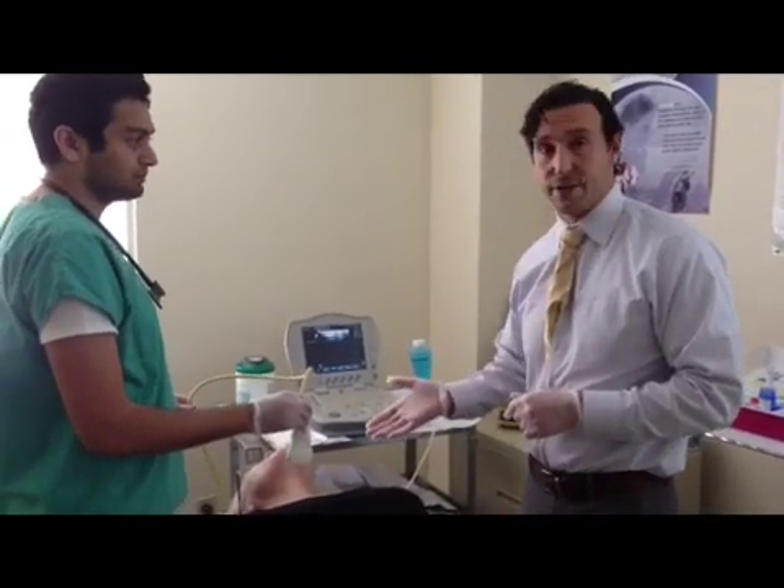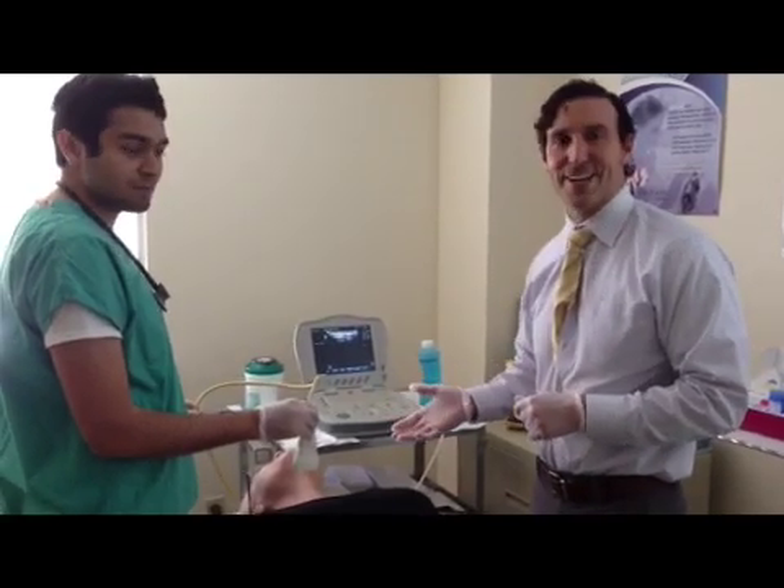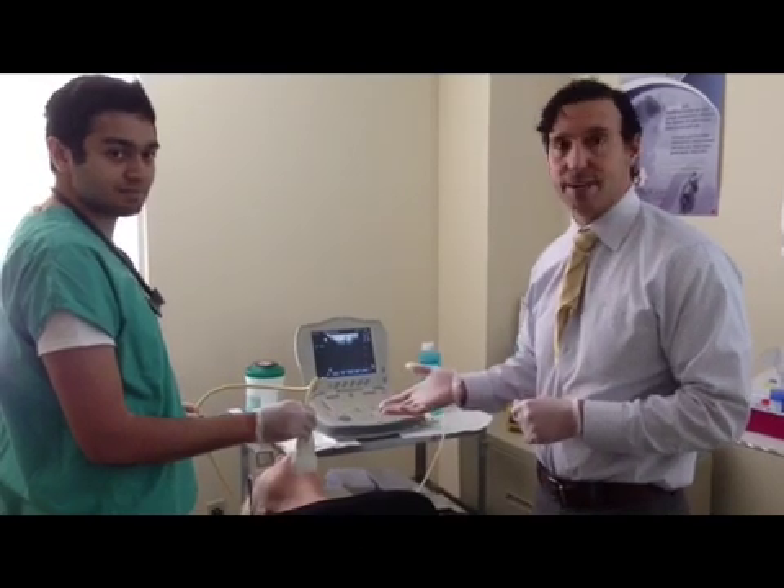The patient is currently lying with her neck hyperextended. This is to expose the area of the neck to make the procedure much easier and obtainable.